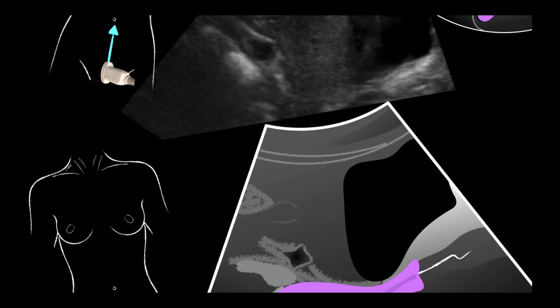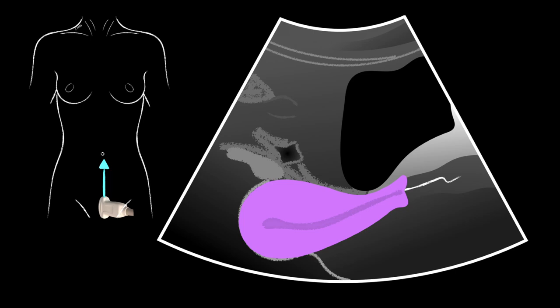In patients with a retroverted uterus, we look for fluid along the posterior bladder wall — this is the most dependent area we'll see in the pelvis. Although the right upper quadrant is typically the most sensitive view for free fluid, if your patient has been sitting upright or ambulated into the emergency department, that may not be true. You may need to evaluate the pelvis first in those select cases, because gravity-dependent fluid will collect there.